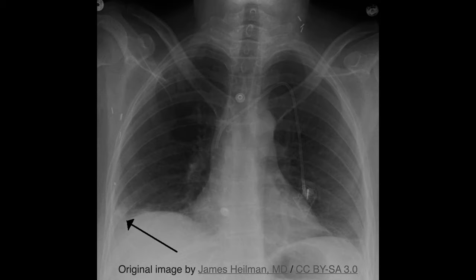Another rare but suggestive finding is Westermark sign, which is not evident in this x-ray. In contrast to Hampton's hump, Westermark sign occurs when peripheral oligemia due to infarction appears on the x-ray as a focal wedge-shaped area of hyperlucency — that is, increased blackness — as opposed to opacity.